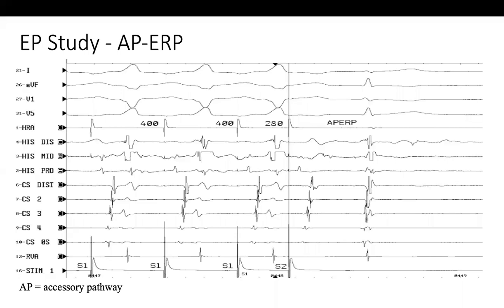I know that a lot of people are using it, but I think it's making more confusion rather than diagnosis. And we could see a lot of patients who underwent adenosine injections during the EP study and tend to have a real accessory pathway after that. Thank you so much, Dr. Ahmed.